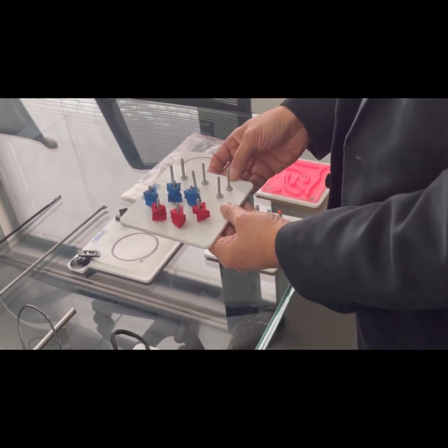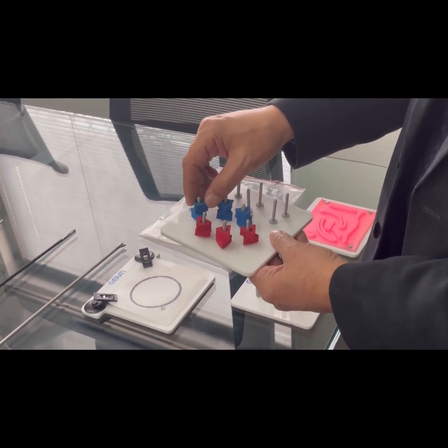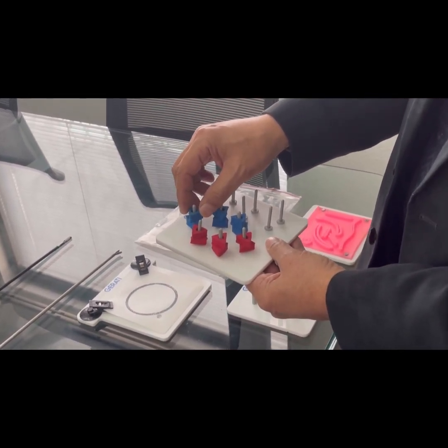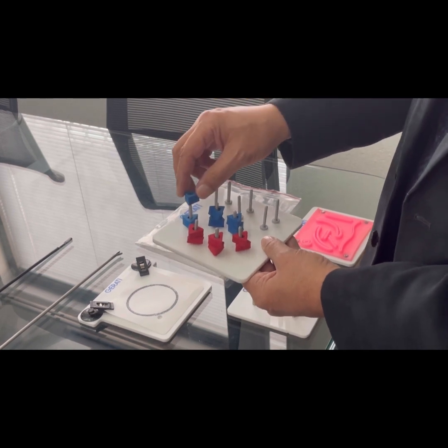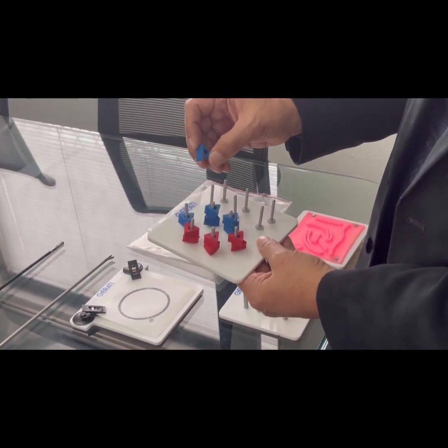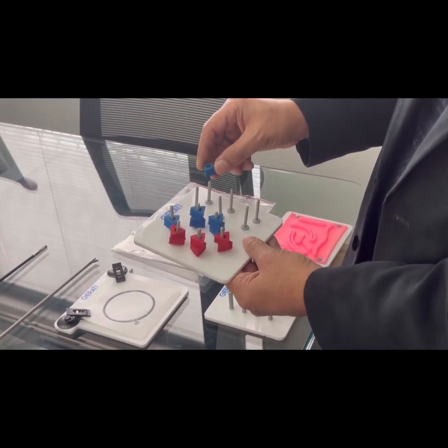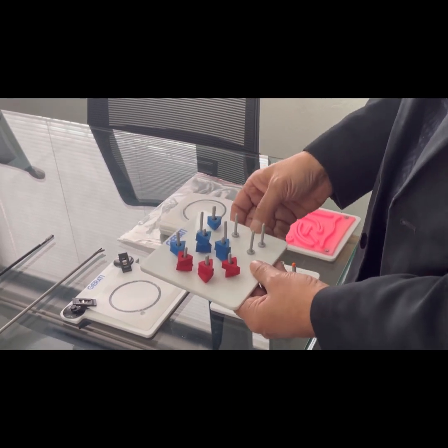In the peg transfer module, pegs are taken from one side. Using the left hand, you pick up these triangular foam materials, exchange them mid-air to the right hand, shift them to the other side, and then repeat vice versa.